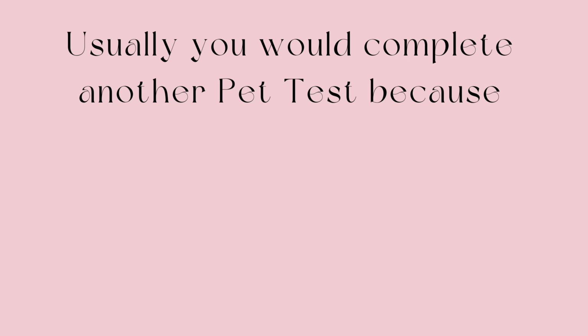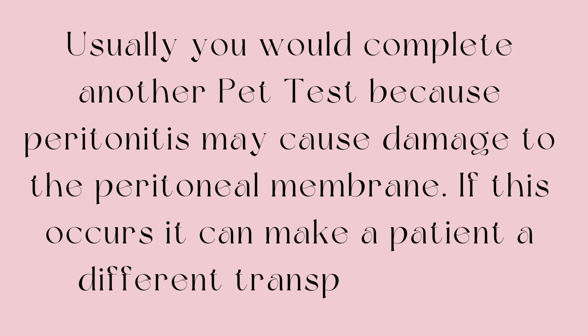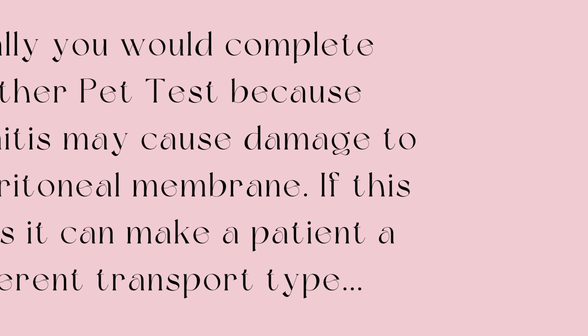Why would another PET test need to be completed? Usually, you would complete another PET test because peritonitis may cause damage to the peritoneal membrane. If this occurs, it can make a patient a different transport type, thus making the current prescription inefficient.